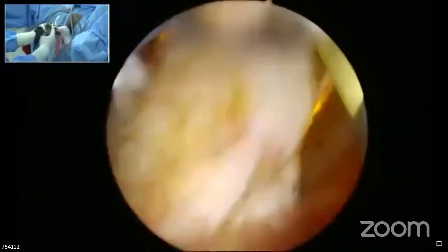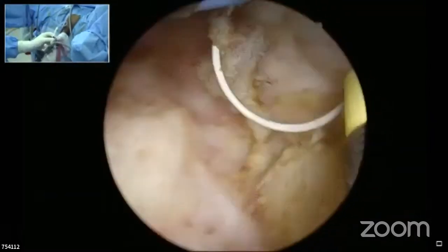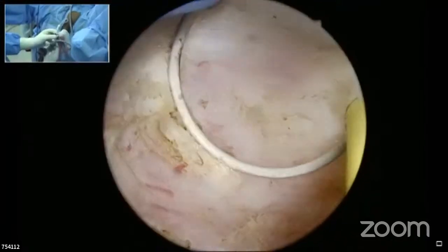What do you say, sir? No, I agree with you because what you are seeing is in magnification. And yes, the moment you put your catheter, it will collapse.